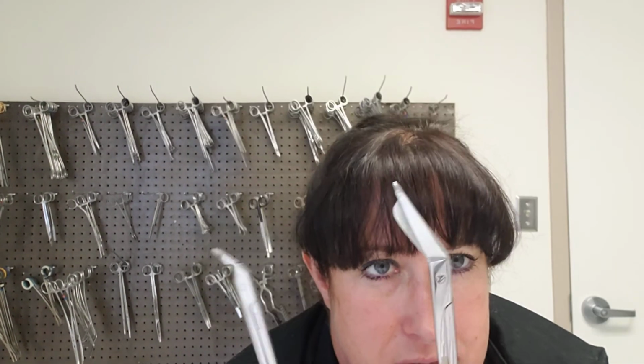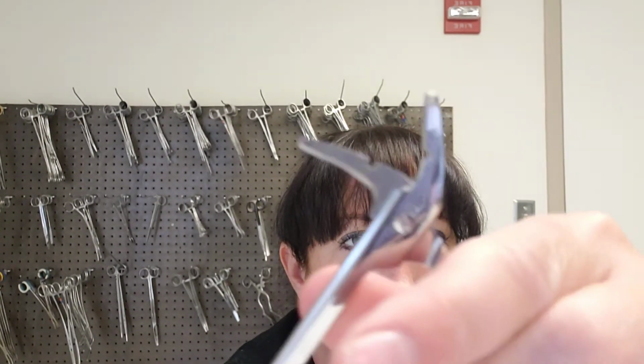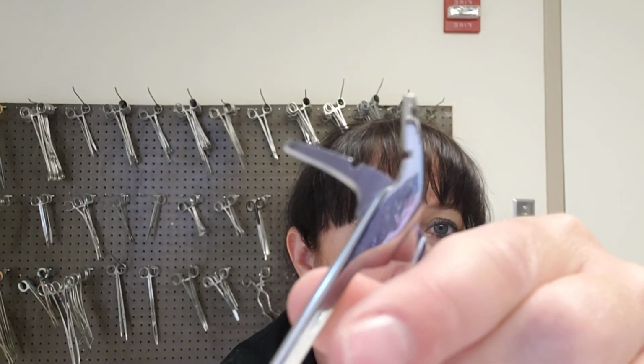Got all those. Here's a couple more. I've got these two scissors. They're both kind of funky angled. This little one, can y'all see how there's this little hole in there? You'll see these notches. These are wire cutting scissors. Don't use anything else to cut wire other than these, otherwise you're going to damage your scissors.